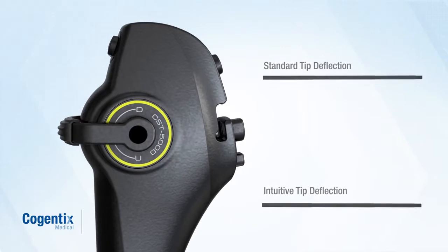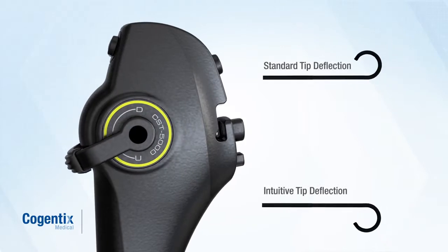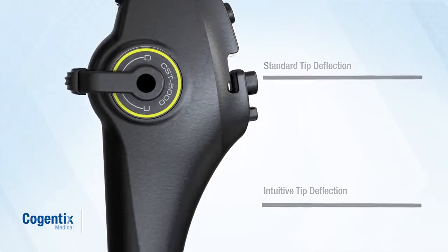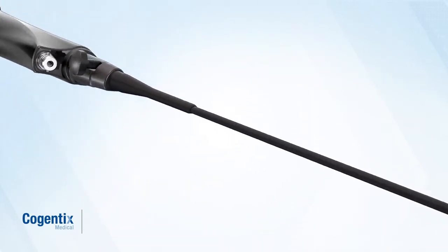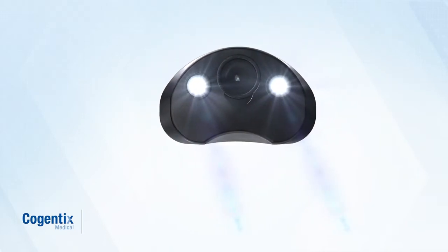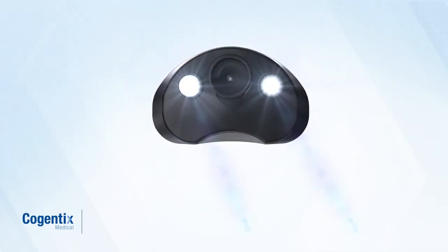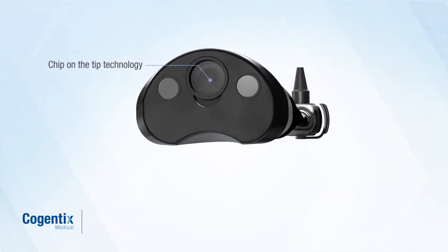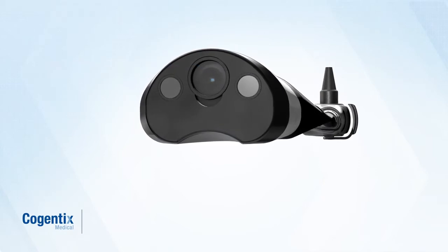This easy-to-use flexible digital cystoscope is indicated for use during cystoscopy and is available in either standard or intuitive tip deflection. Stunning image quality and LED illumination eliminate the need for a separate light source. The digital cystoscope employs chip-on-the-tip technology that integrates with Cogentix Medical's digital processing unit.